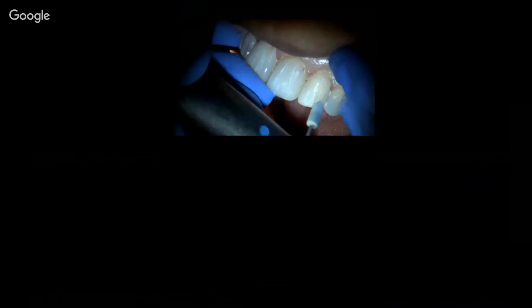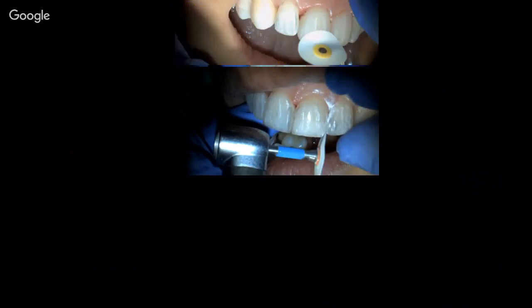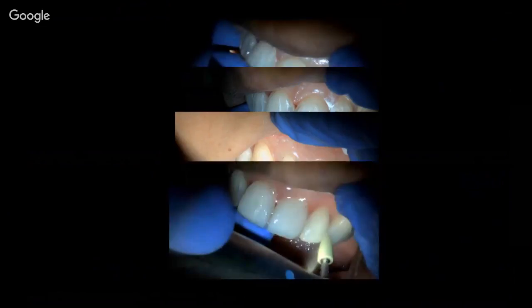So let's start making some vertical grooves, as well as changing the shape of the ridge, and all of the surface is literally modeled by our tools. And then we have to make everything clean, smooth, and shining.